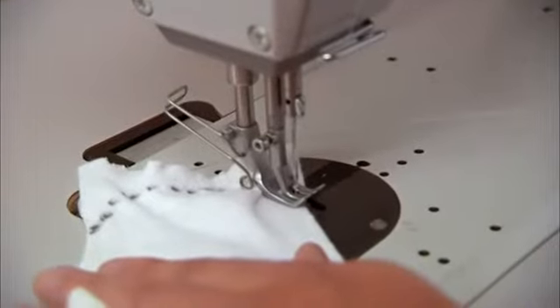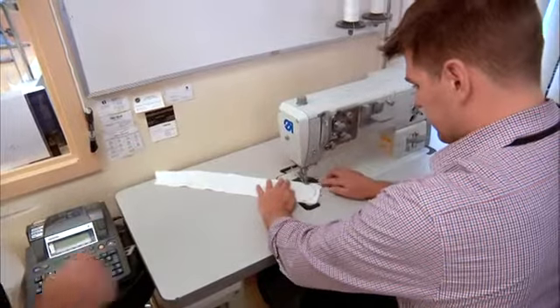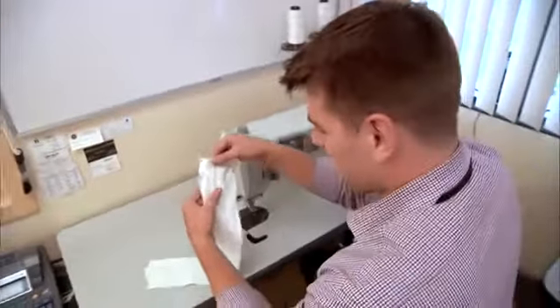Lock it in, reverse. And the string pulled out. So, as you can see, mine doesn't look nearly as good as Brian's.